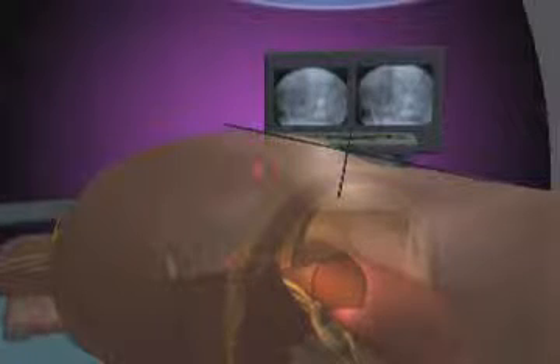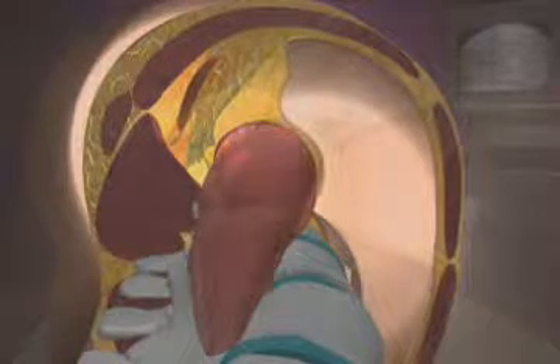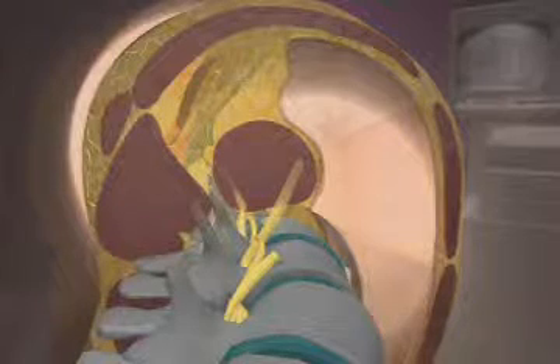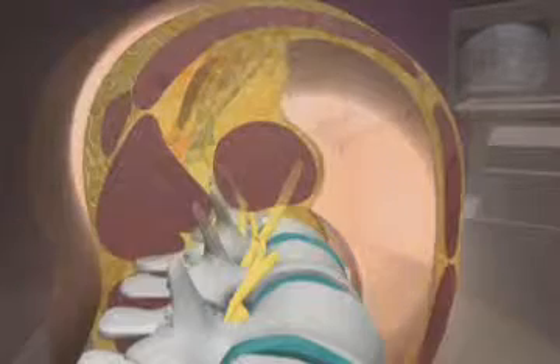A separate small incision is first made toward the back. The surgeon uses his or her finger through this incision to feel the space in the side through which the instruments will pass. The finger will also guide tubular dilators into safe position.